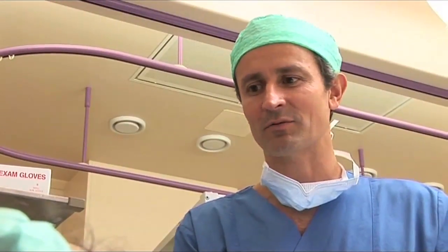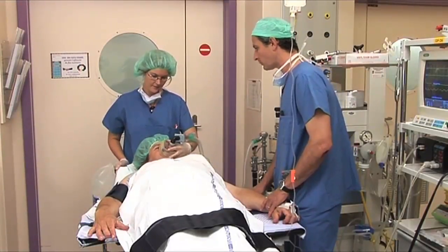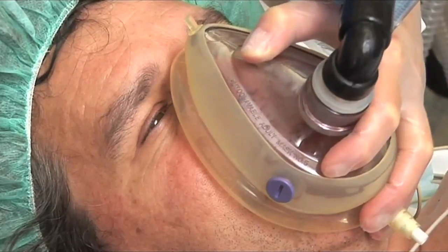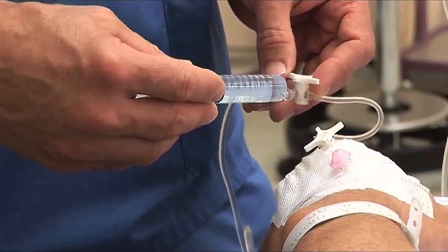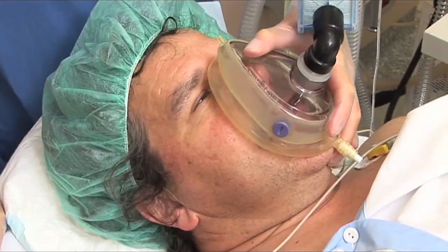The team prepares Mr. Martin for general anaesthesia. He begins by breathing into an oxygen mask containing nothing but oxygen and breathes deeply. The first drug administered is a powerful pain reliever. The patient is reassured: 'If you feel dizzy, just close your eyes and think of something pleasant. We will be with you throughout the entire operation to make sure that everything goes all right.'